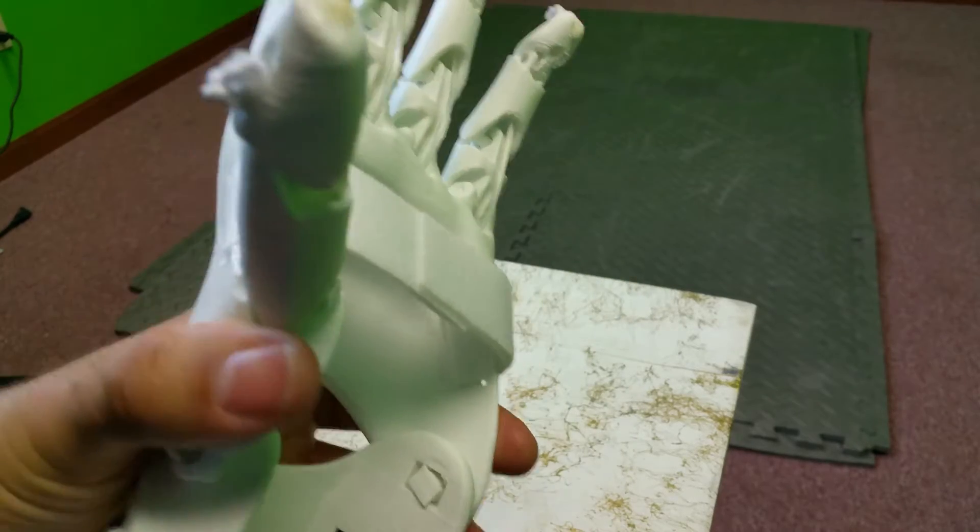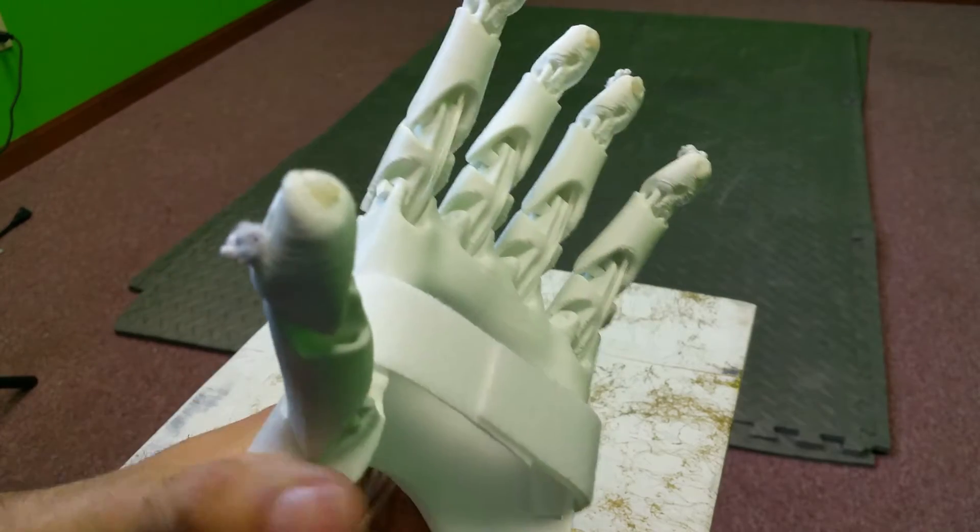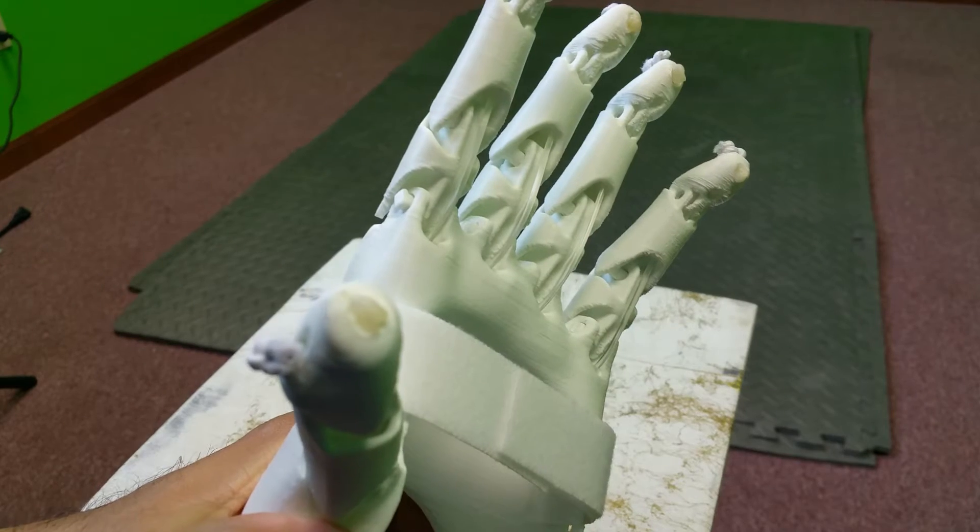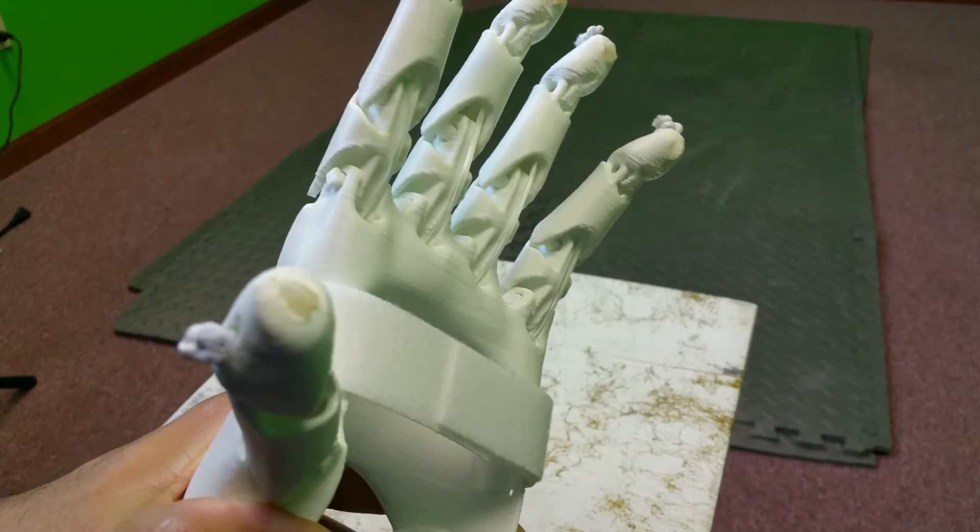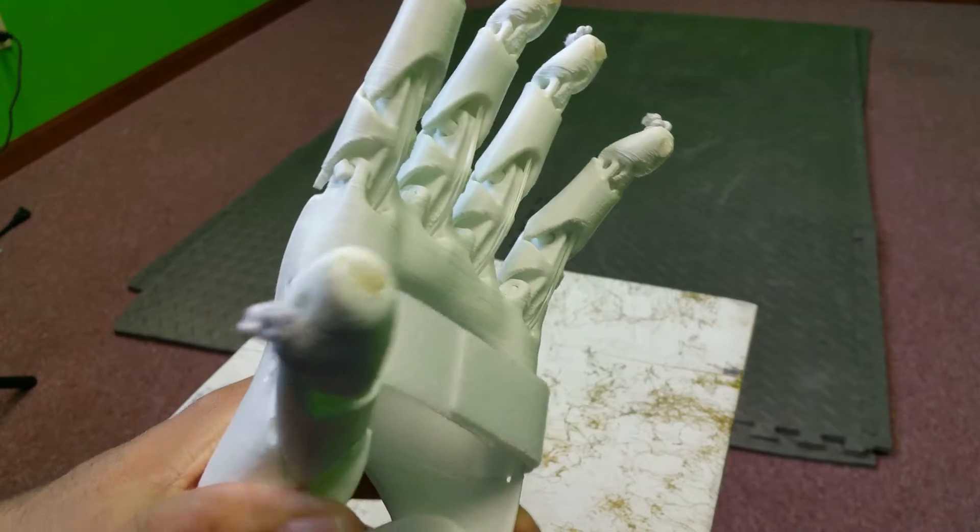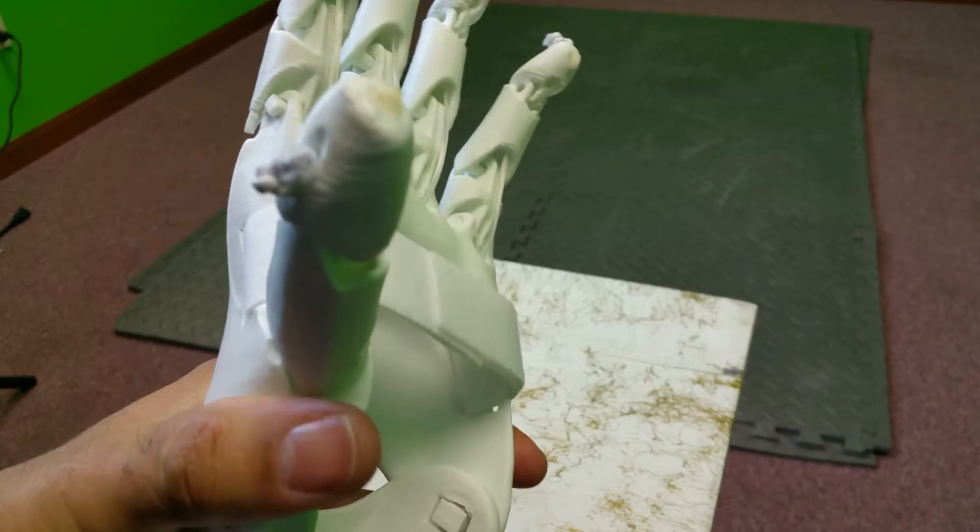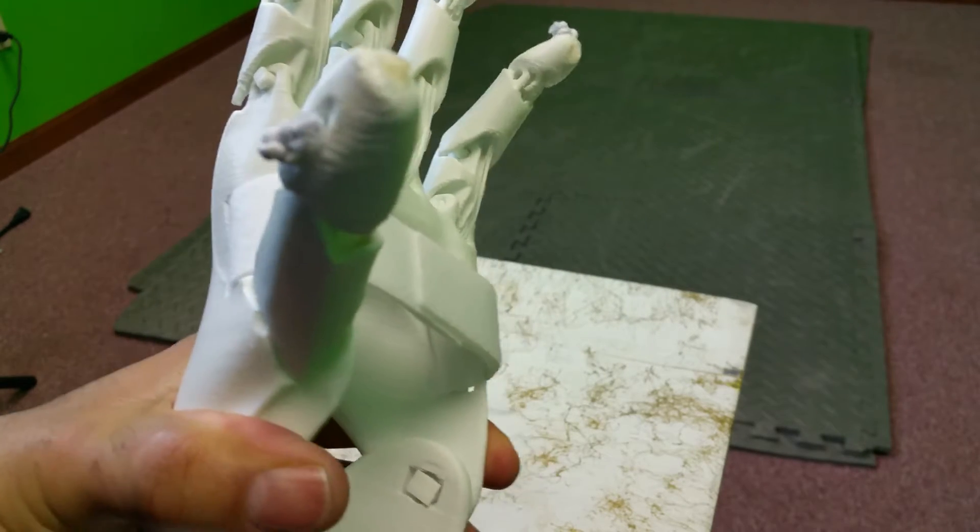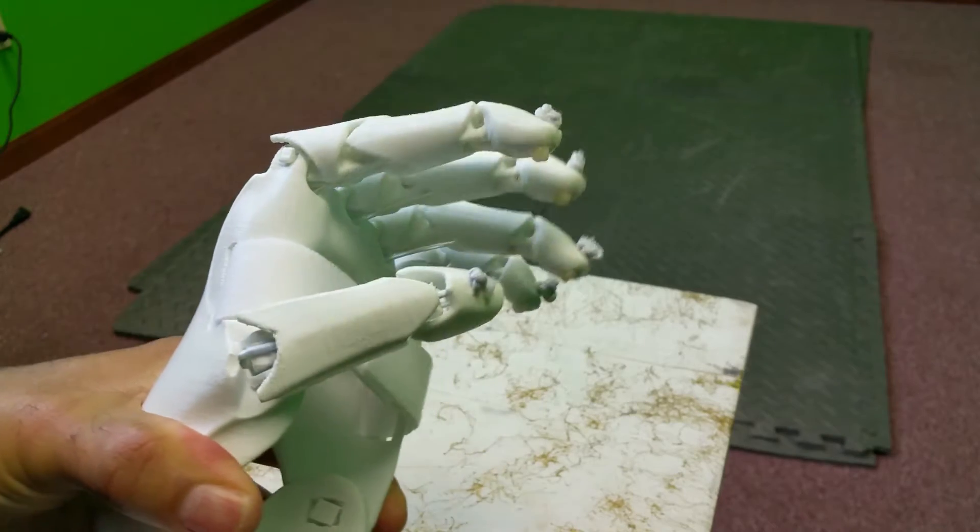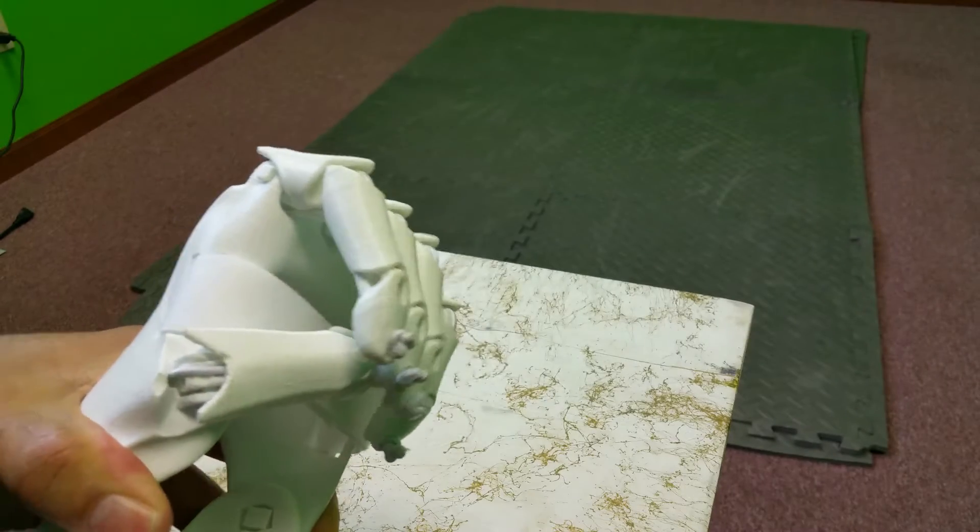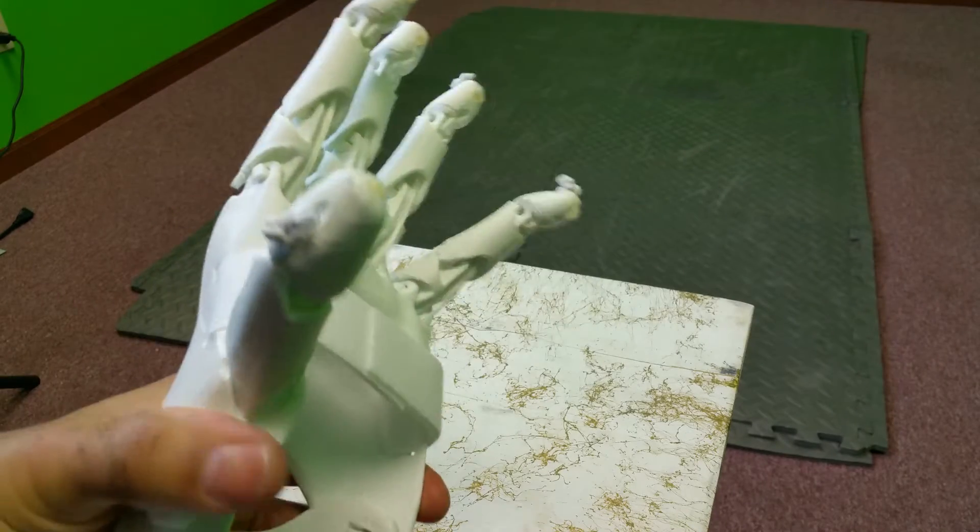You'll notice that using the bridge filament allows you an added benefit of functionality. So closing the hand obviously functions very well.